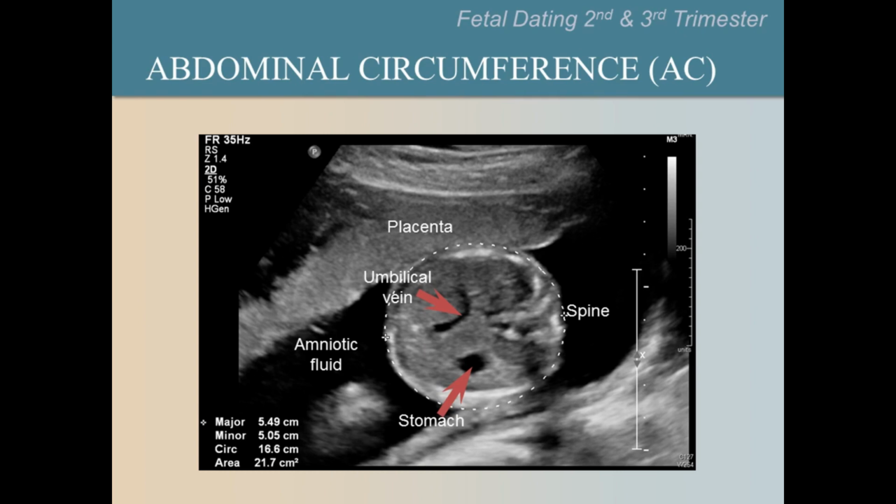Please pause the video now to discuss within the group. The answer is that the baby is in a longitudinal lie with a cephalic presentation. The fetal spine is on the mother's left.